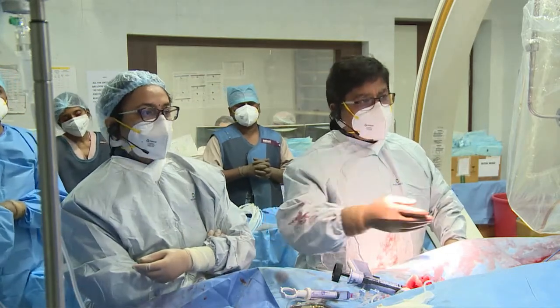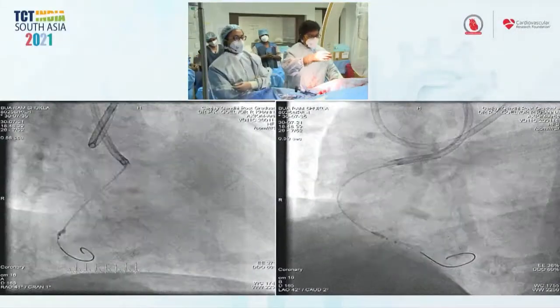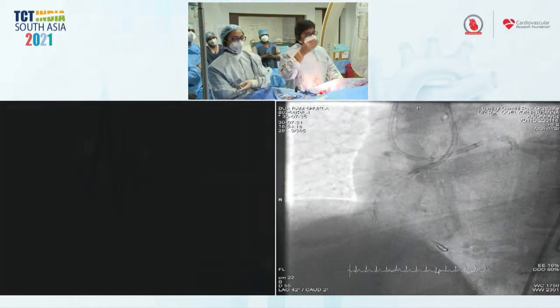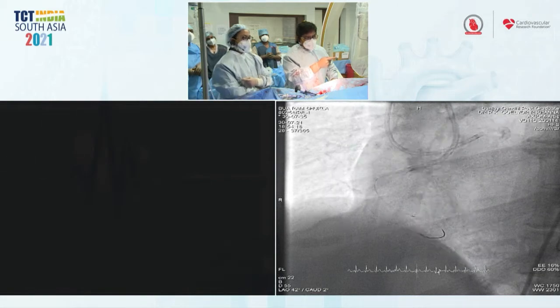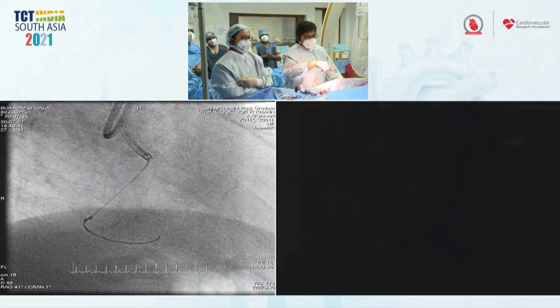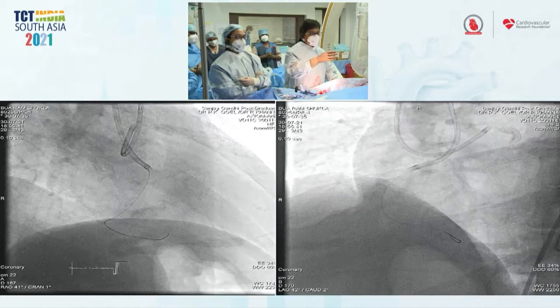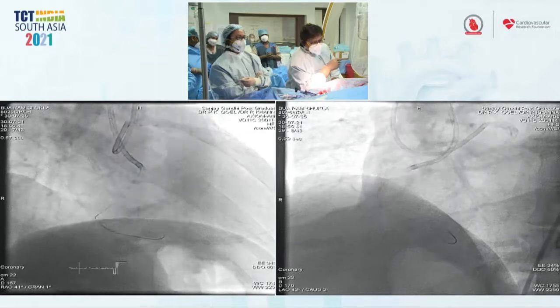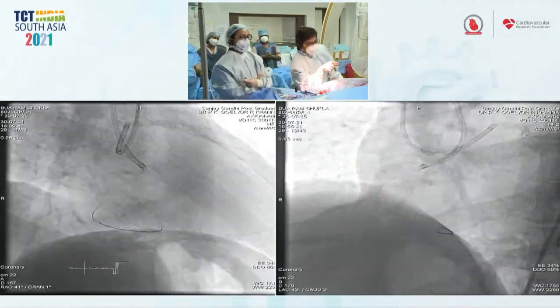I cross-checked it, and we see through a PDA into some branch or something. So then we realigned it, and that is where we are. We then took out the Stingray, extending the wire, we took it out, did some balloon dilatations, and I have done with a 2 millimeter balloon. Now you see my contralateral injection, I can't see the right. Why? Because it's probably flowing antegrade. That's why we don't see it so well, okay?